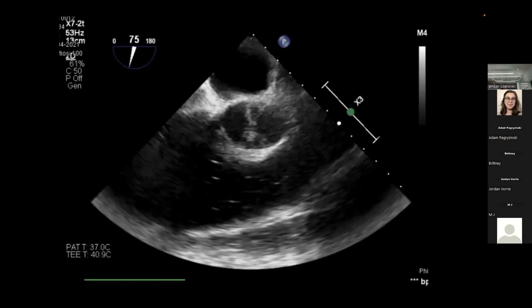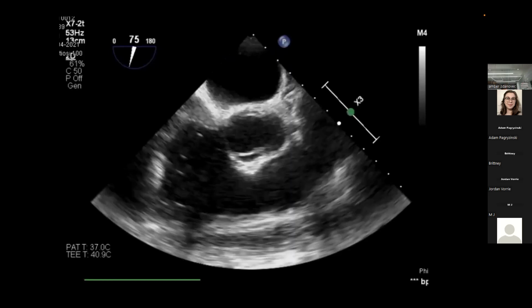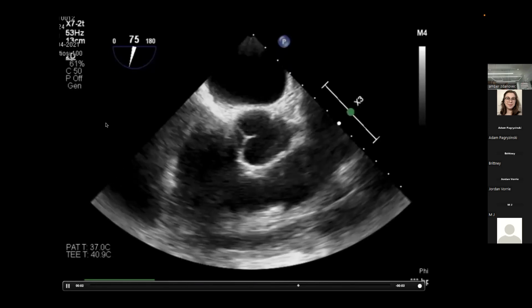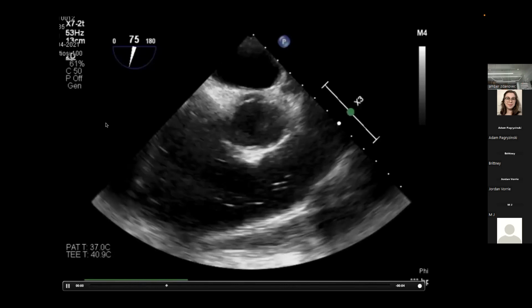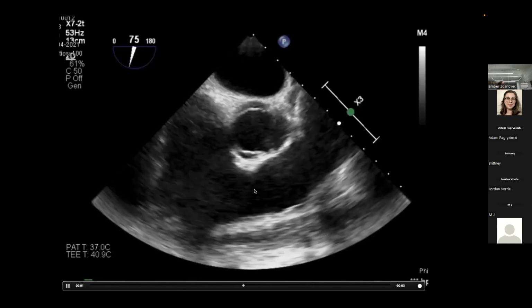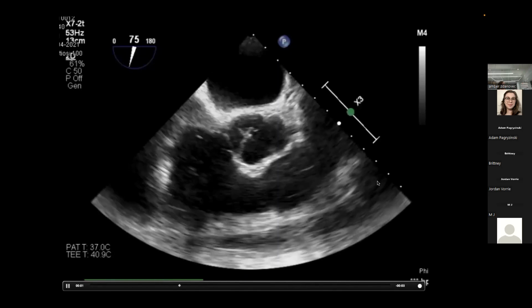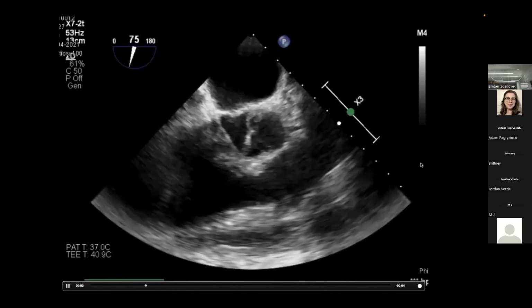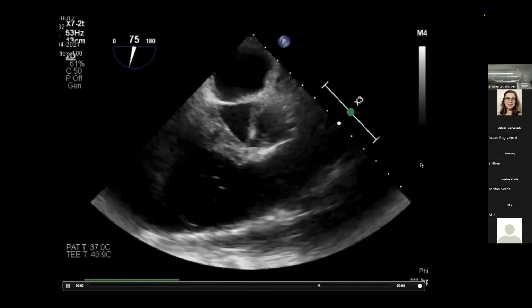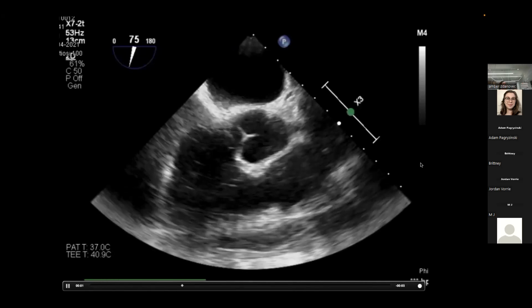And now what is this view? So usually this view is obtained at about 60. We're a little beyond that, but that's okay. Yeah, so this is your esophageal RV inflow-outflow tract. Up here is going to be your RA, your RV, and then going into your PA. Your tricuspid's probably around here, and your pulmonic, I think you can see whiffs of it right here. So it's another view to see how well the RV is squeezing. What do we think? Looks okay. And remember that even if there is a little bit of RV dysfunction, if you improve hypoxia, things should get a little bit better.